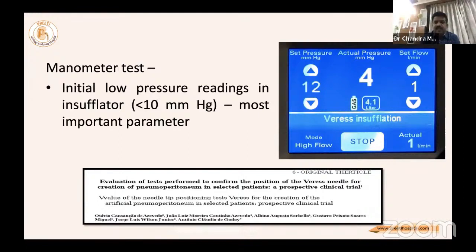In the cylinder, it is in liquid form. Once it comes out, it is the gas form. Once the gas comes, temperature is low, and immediate fogging will be there. To avoid the fogging, you have to do only 3 things. One is go slowly into the abdomen. Two is apply betadine or any other surfactant, or hot water to equalize. Otherwise, the next point is you change the inflow to another port. This is all most important.